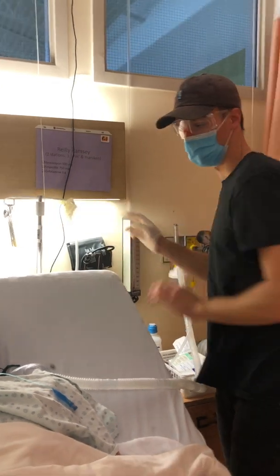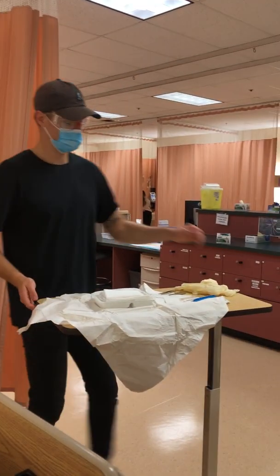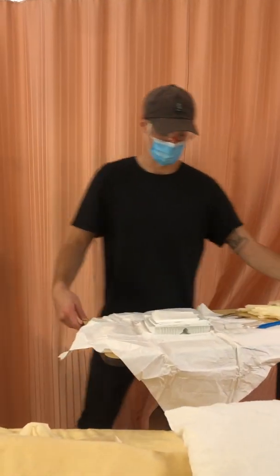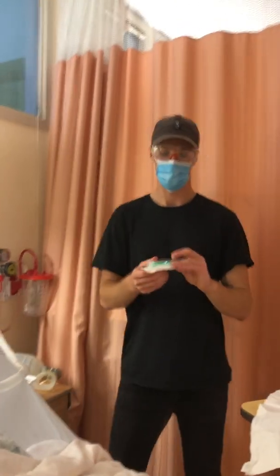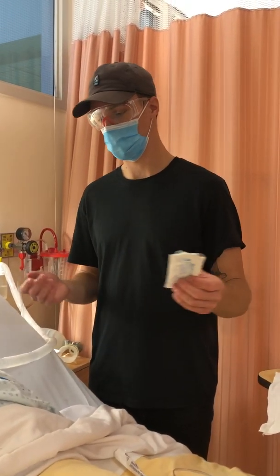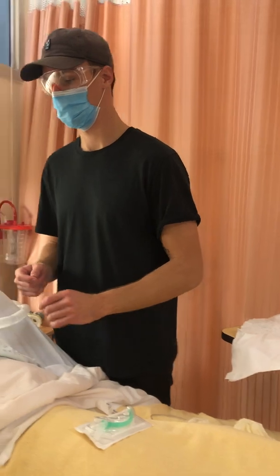Alright, so now in the meantime I can reattach this just so my patient can get some humidified oxygen, and I'm going to grab my sterile field, which I opened before. Alright, so I perform hand hygiene. Next I grab my inner cannula. I need a size 7, which the patient has in already. I have it here, it's the same color, so it's the correct one. So that's the first thing I'm going to be doing. I'm going to be replacing the inner cannula.